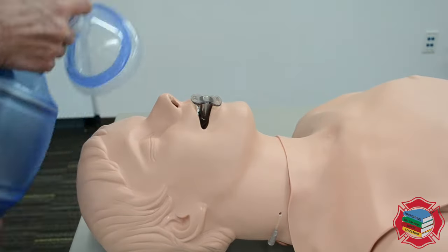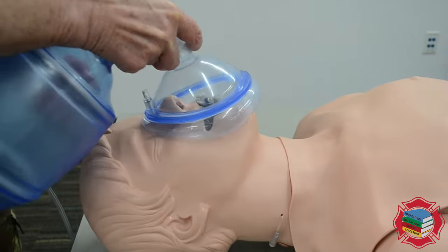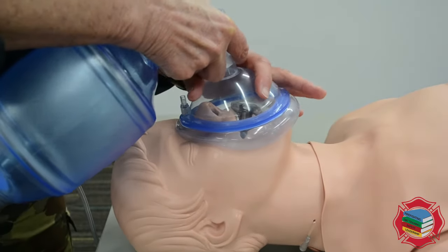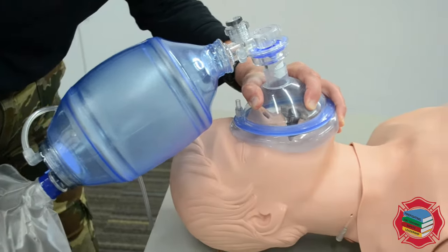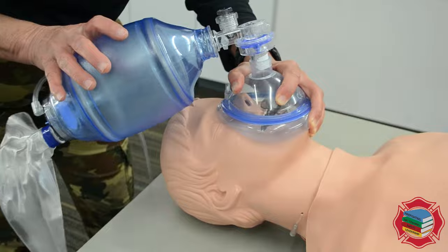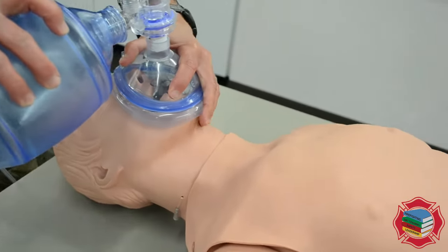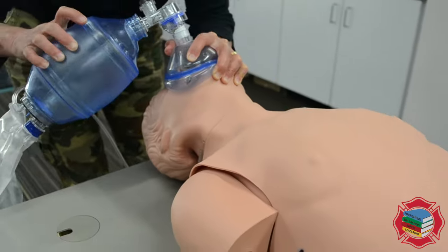I'm gonna measure this from the bridge of the nose to the cleft of the chin, making sure I'm clearing the flange. I have my CE grip with my non-dominant hand — I'm right-hand dominant. Now I'm gonna bring the bag around, open the airway, and squeeze the bag.